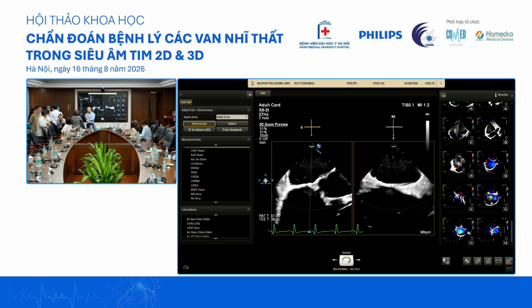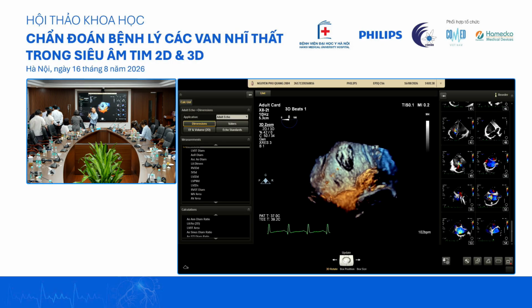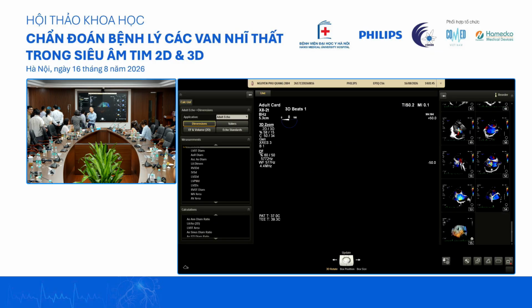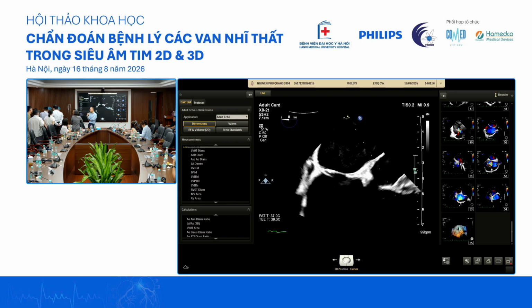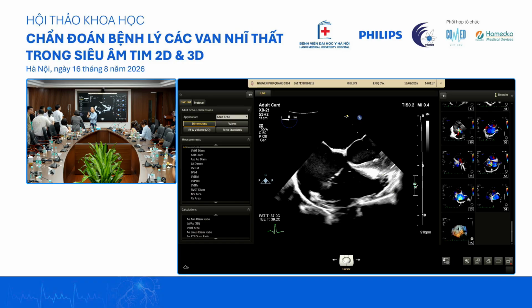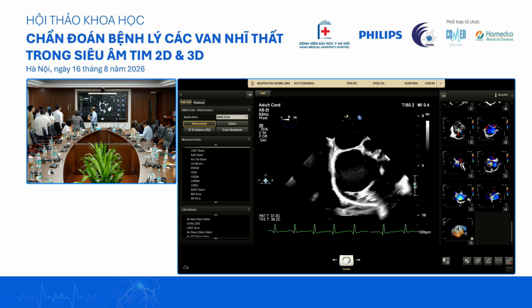For the clip 6. But because the clip needs to hold the leaflet, we need the leaflet length to be at least 6 for it to hold. Anything shorter than 6, the clip is not able to hold. Yeah. But you can actually see that the coaptation overlap between the septal and the anterior leaflet is almost down to the last millimeter. They're just all stretched.